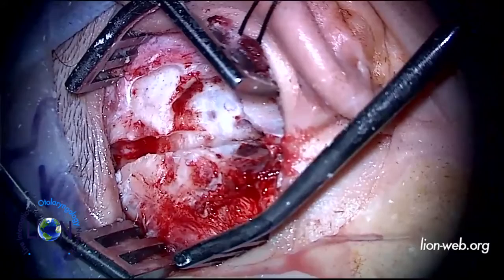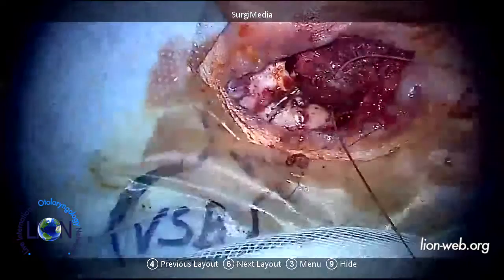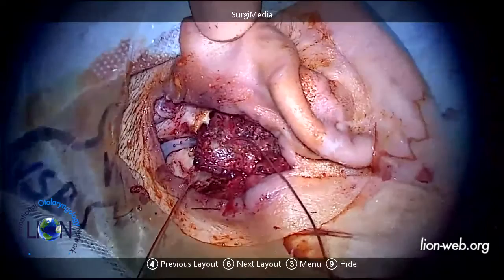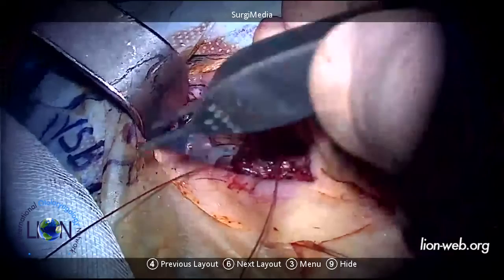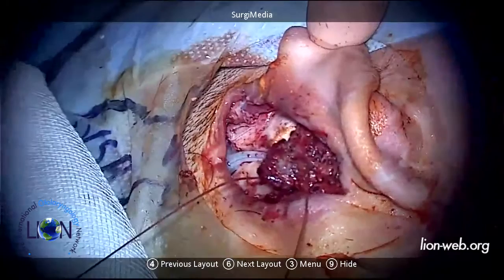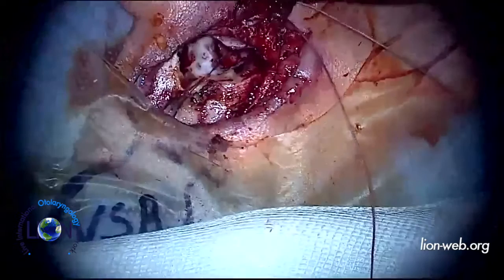Can you show us the screws? Yes, I tried to show you some screws. Here. You see I did a well for the implant. And here is a screw. Yes, okay, we see that. Here is one and the second one. Okay, we get the picture there. And I notice your muscle flap is now coming back. Can we see the floating mass transducer? Yes, I'll show you, no problem.